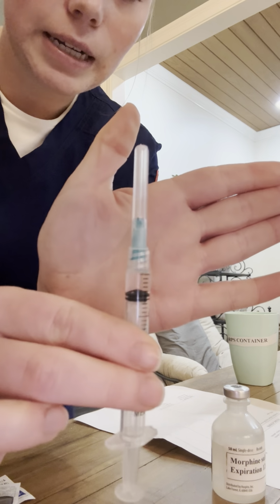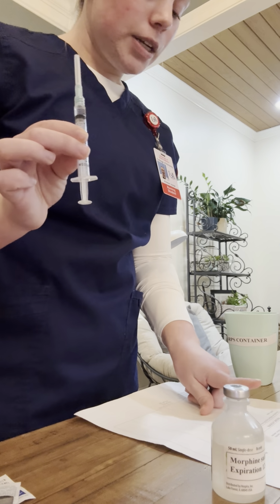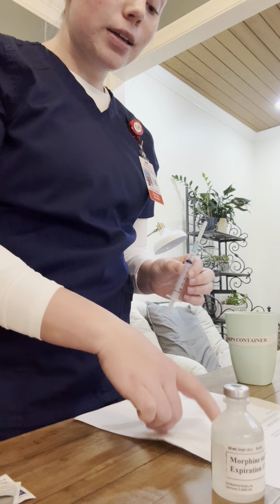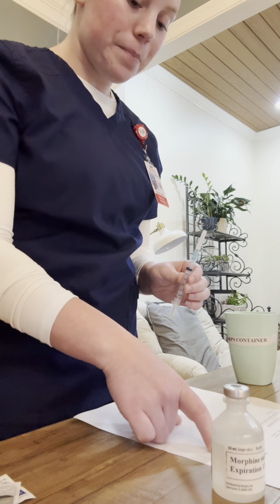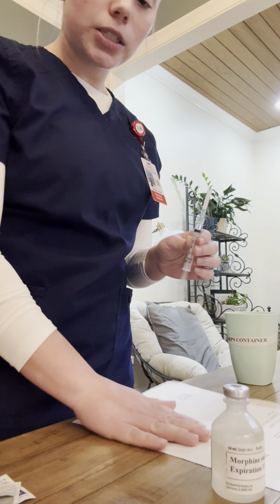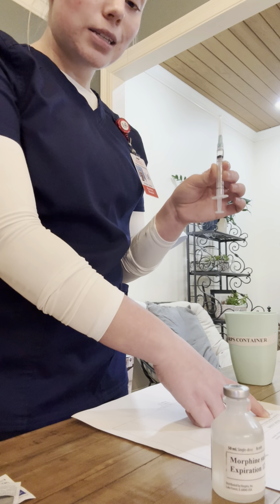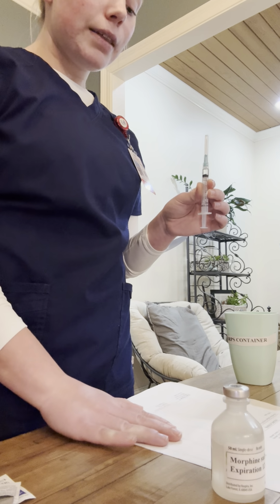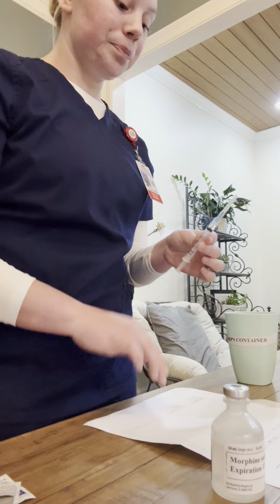So now I have the correct needle and the correct syringe to give this medication. Now the timing, the right time to give this medication is every 4 hours. I know that it has been longer than 4 hours since they last received this medication, so this is an appropriate time to give it. The right indication is PRN for pain. We know that our patient is in pain, and we also know that morphine sulfate is a pain-relieving medication, so this is an appropriate medication to give under these circumstances. And then correct documentation would be that all the elements of a legal prescription are included.